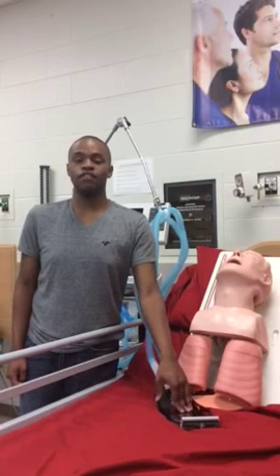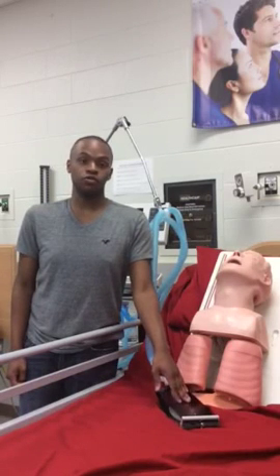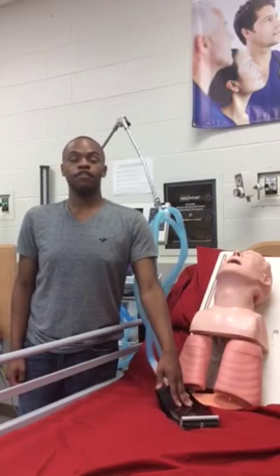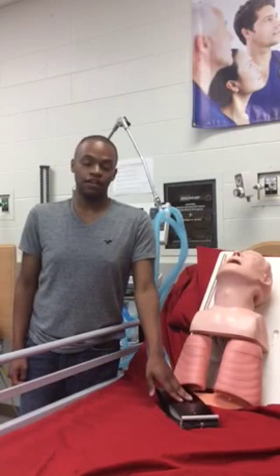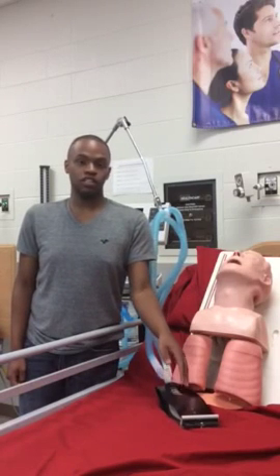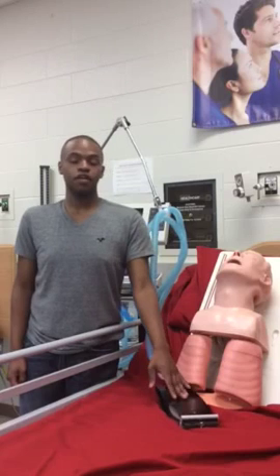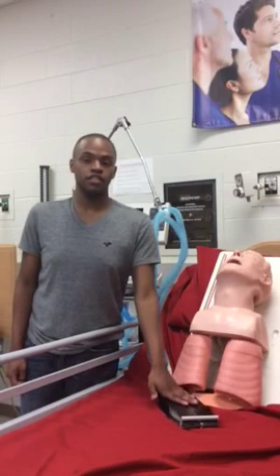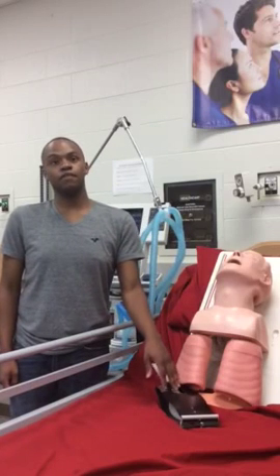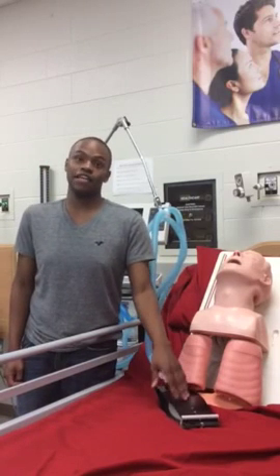Next, I look at her NIF, which helps me to see her respiratory muscle strength. It happens to be negative 45. We usually want anything over negative 20. So that's more than double of what she's supposed to have. So we're happy. I report these to Dr. Smith, and he's happy. Now he wants me to non-invasively measure her oxygenation and carbon dioxide levels.